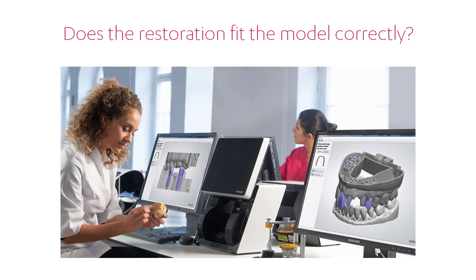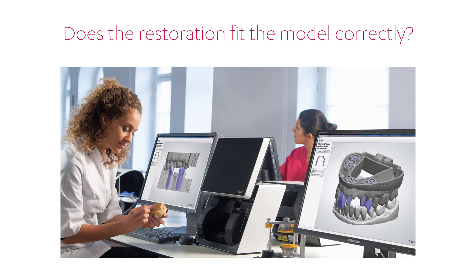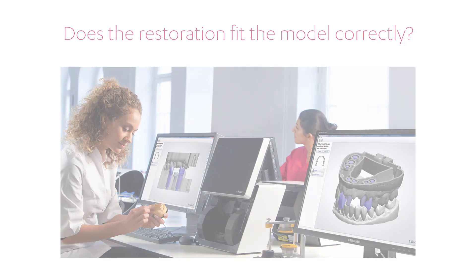Check if the restoration fits the model. If not, you should check whether the drill compensation and cement space parameters are set correctly. When they are set and the fit is still not acceptable, contact your 3Shape reseller for assistance.